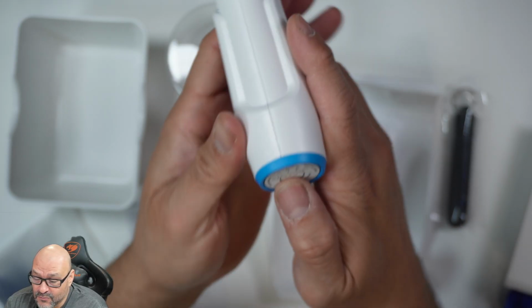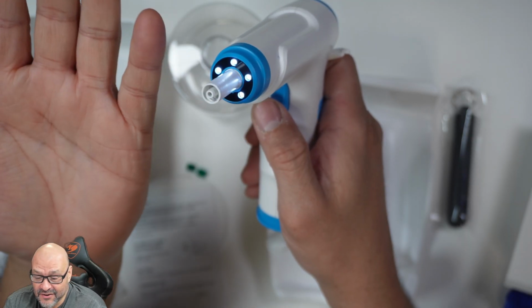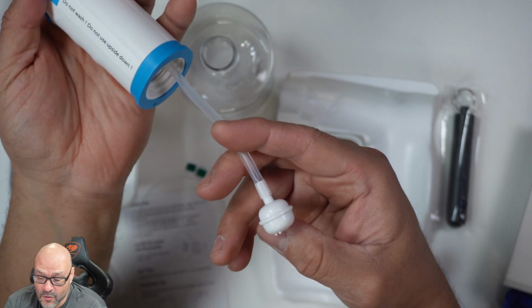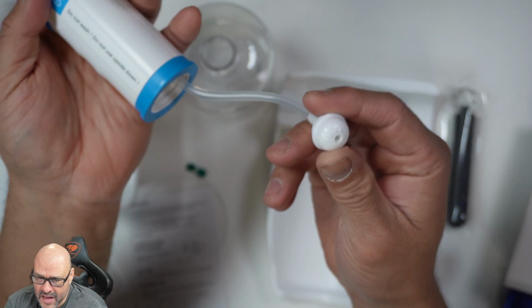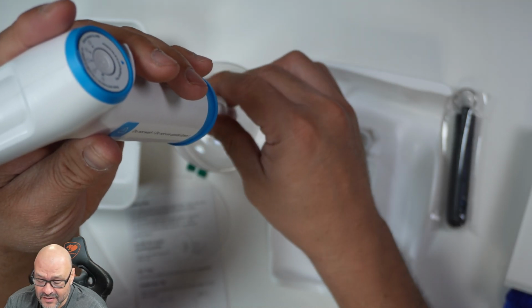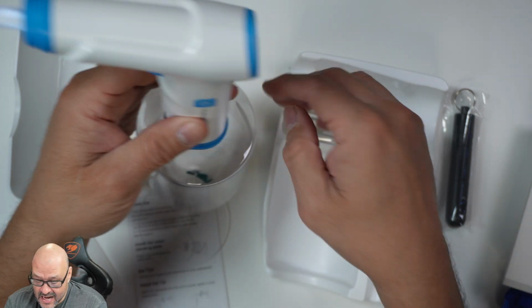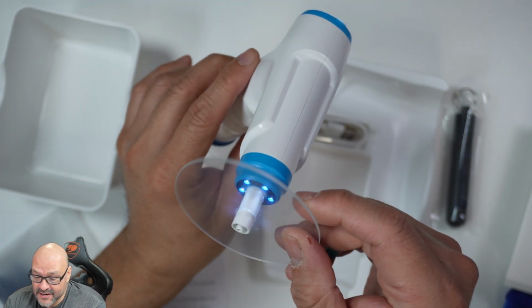And I'm going to show you guys when you turn it on, the light goes on and it's pushing out air, right? Because it's actually going to suck all the water from the bottom. And it has a little bow kind of thing in the bottom hanging in there. And this kind of drips in there. You gotta go in here, retain it here, twist it. That's pretty much it. This blocker goes in here.